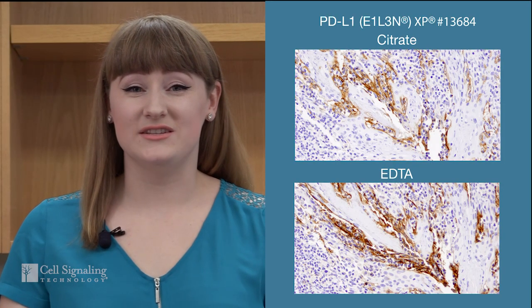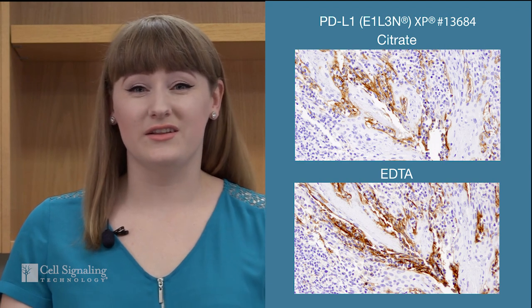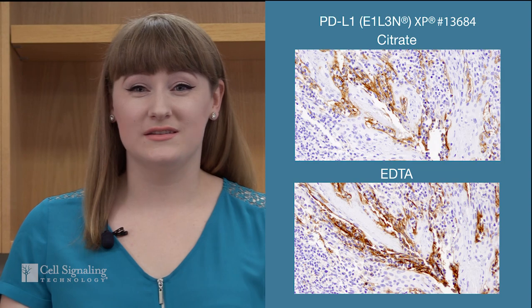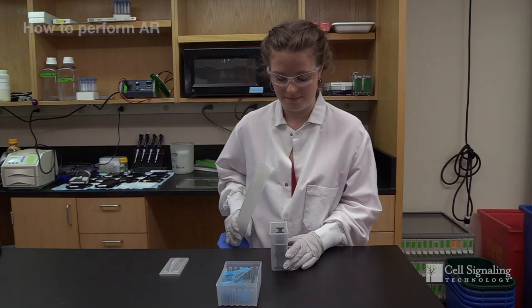Many antibodies will work well with antigen retrieval performed with citrate buffer. Often with EDTA, you will observe increased signals, but possibly increased background as well. Antibodies that work with citrate buffer are likely to also work with EDTA, but may require further optimization in order to achieve the best signal-to-noise ratio. Conversely, if an antibody requires EDTA for retrieval, it is unlikely to work well with citrate. The antigen retrieval buffer that we recommend with our products can be found on the product's datasheet.